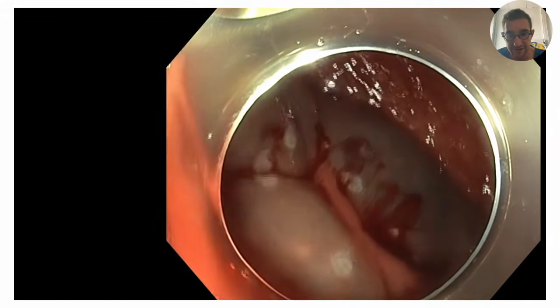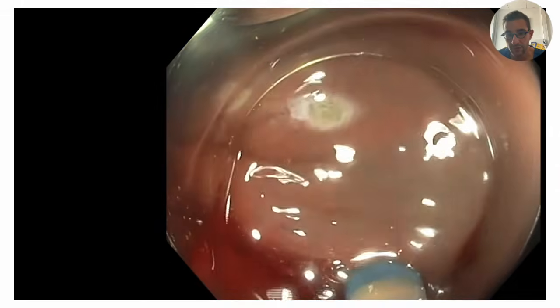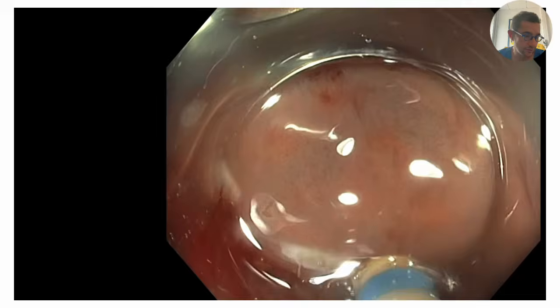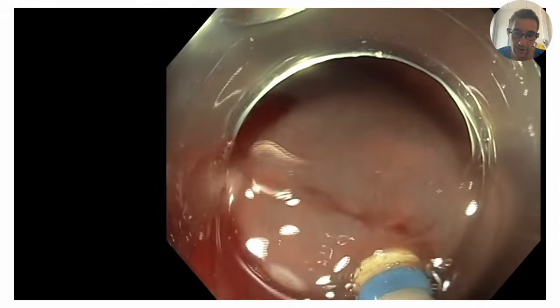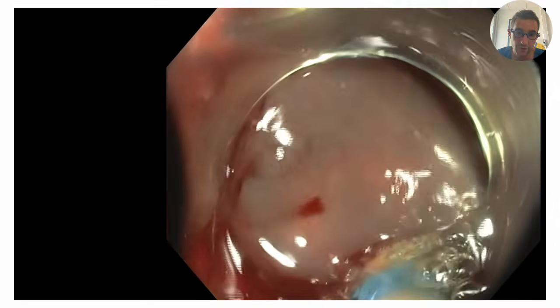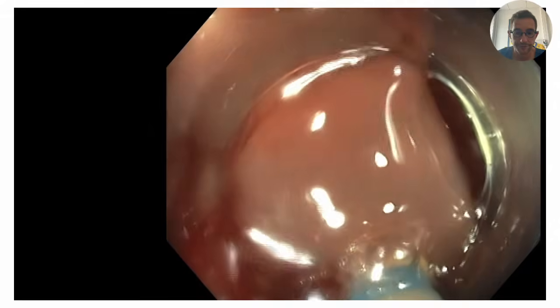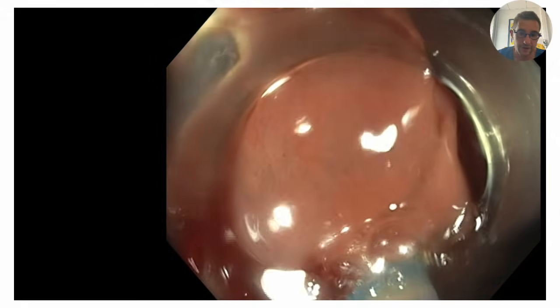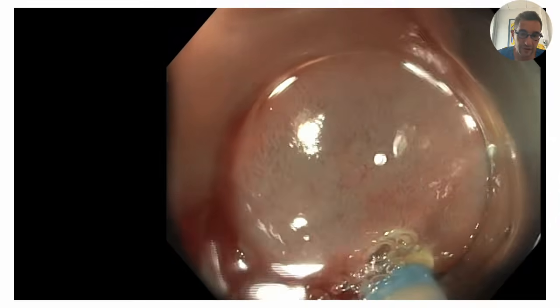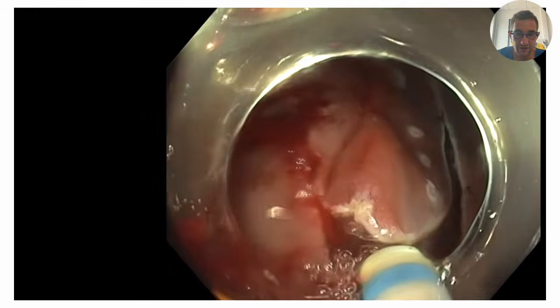You can see that at the end the central area is difficult to enlarge, but once we have done the incision and the trimming at the good depth, we will be able to place the traction and finally find this blue layer deep into the submucosa, close to the muscle, which is for me a good way to find again a blue layer able to be dissected, compared to what we can see at the central part of the fibrosis.